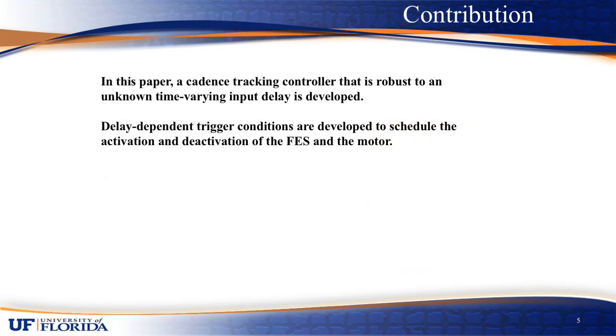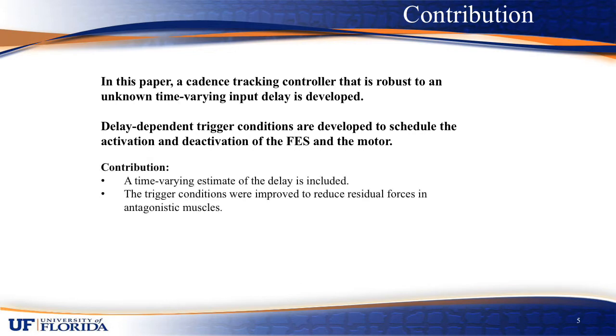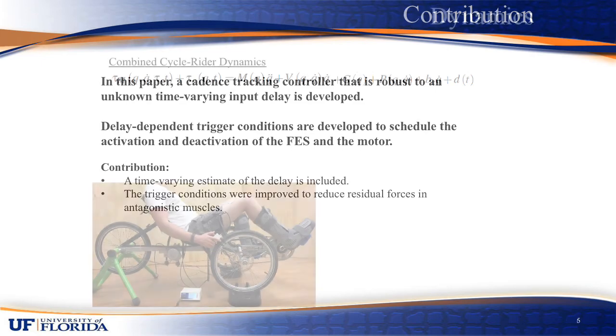In this paper, a cadence tracking controller that is robust to an unknown time-varying input delay is developed, and delay-dependent trigger conditions are developed to schedule the activation and deactivation of the FES and the motor. The contribution of this paper is that a time-varying estimate of the delay is included, and trigger conditions were improved to reduce residual forces in antagonistic muscles.